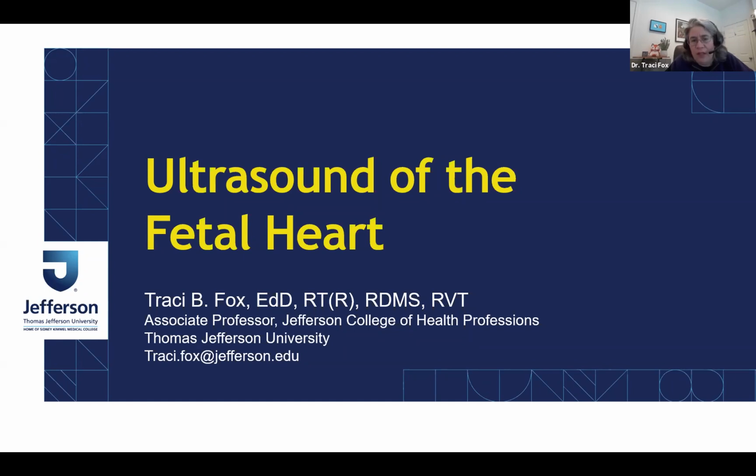Today, I'm going to discuss ultrasound of the fetal heart, the typical views, and how to obtain them. This is not a talk on fetal echocardiography. We will be discussing some pathology. We'll not be doing a lot of Doppler and things like that because there's only so much you can do in the time. For a true fetal echo course, you would need at least 8 hours, preferably 2 full days. So this is more of the normal anatomy and how to obtain the views.